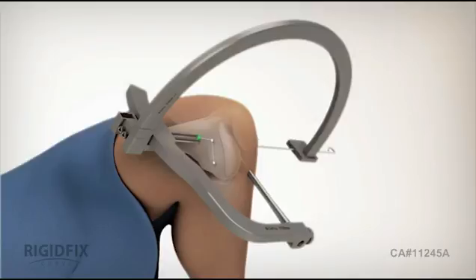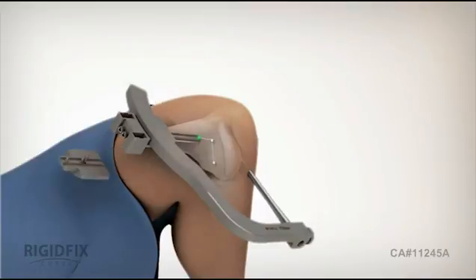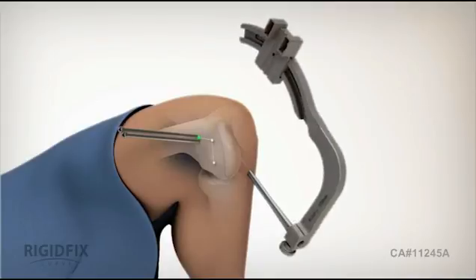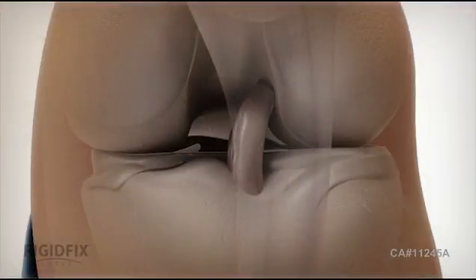With both sleeves now in place, disengage and remove the bone gauge pin, arc, and block cover. Rotate the frame away from the sleeves. Using a guide pin and arthroscope, check the cross pin hole location within the femoral tunnel. Pull the graft through the tibial tunnel and into the femoral tunnel to a depth of 30 millimeters.